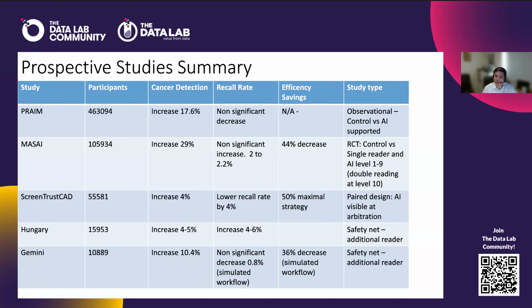So it releases us as clinicians to go and do the additional, more human-facing work rather than reading normal mammograms. As I've said, 6 in 1,000. So there's over 900 normal mammograms. So you can decrease that amount of normal mammogram work and really focus us as clinicians and specialists on the cases that matter. That actually gives you professional satisfaction as well.